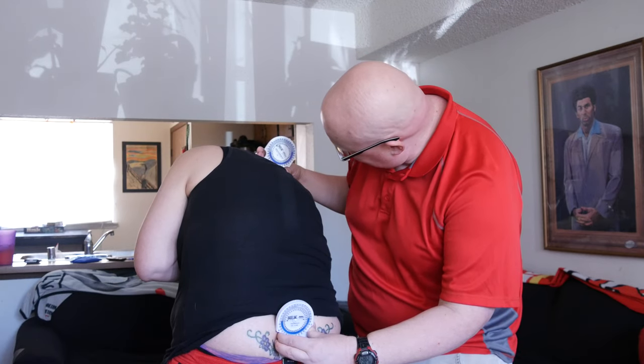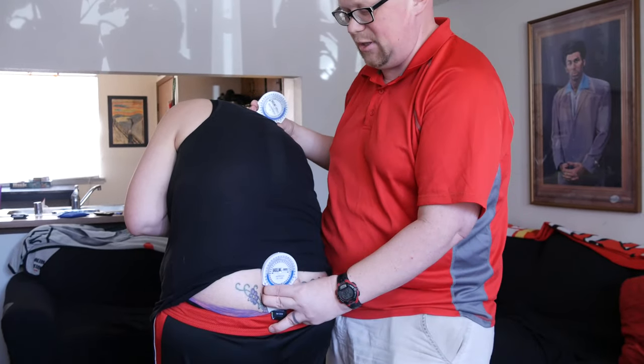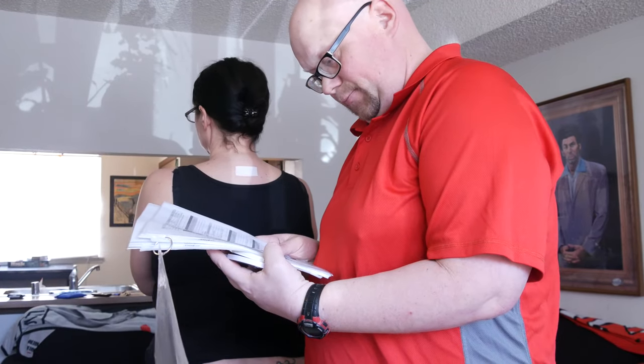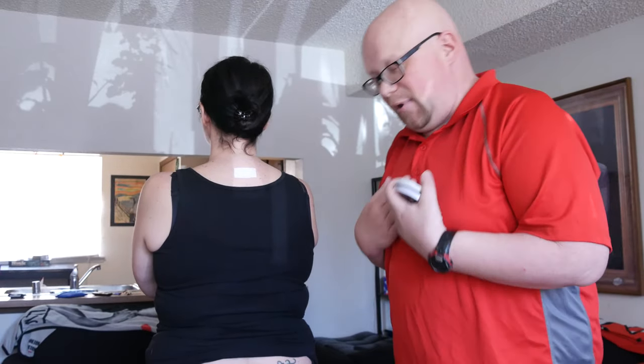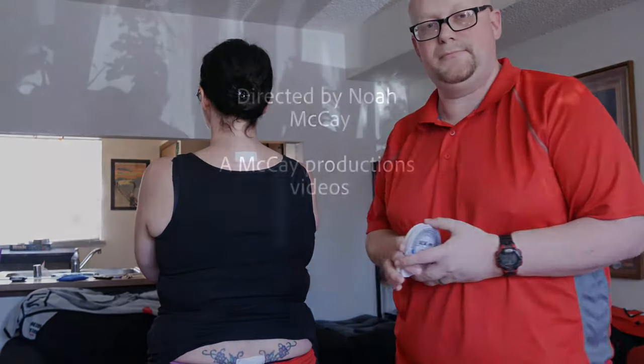We have 45 degrees here with 5 degrees off here, so she's got about 40 degrees of rotation. Rotation normal is 45 degrees — I was remembering wrong. So normal is 45 degrees, so she's pretty close to normal. It's just having them lean forward as far as they can without engaging those hips, and then rotating as far as they can to either side.